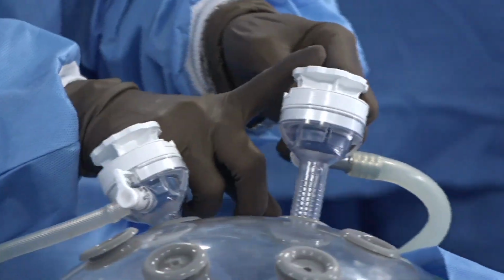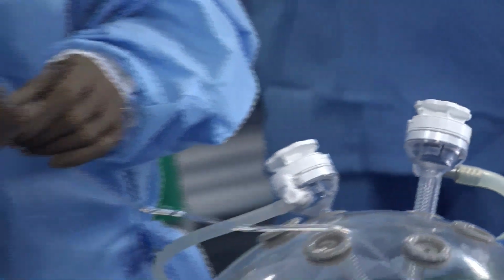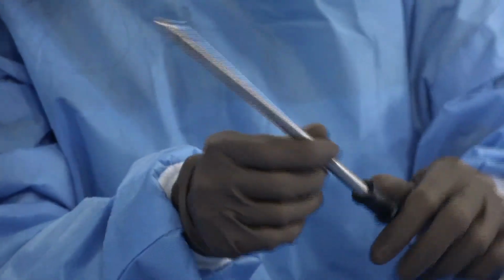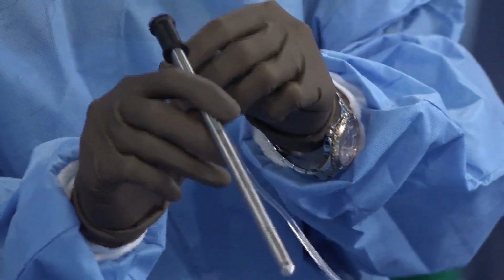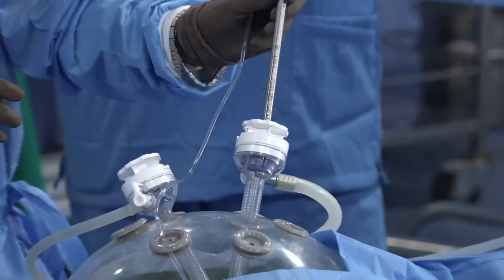And the other thing is this is the other port. This port has to be a 12 mm port, because this capno pen is actually a nebulizer. Can you focus on the pen please? So this is a capno pen. It has a shaft diameter of about 11 to 12 mm, which will not go through a 5 mm port. So this will go only through this 12 mm port.